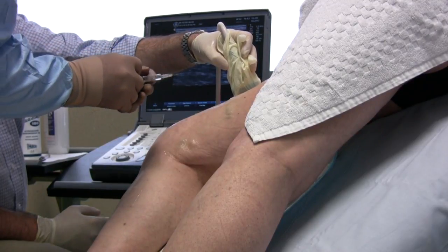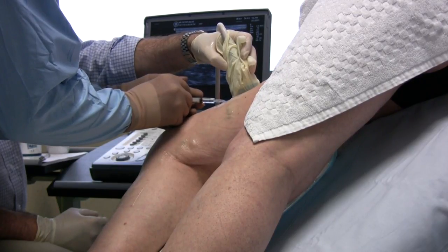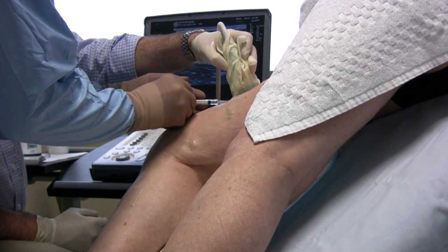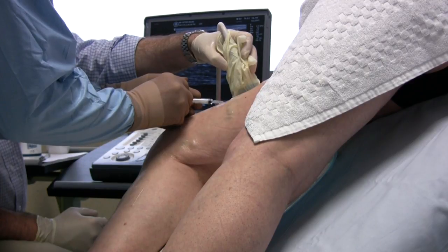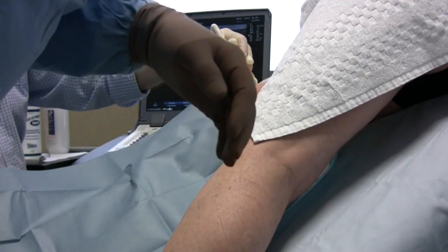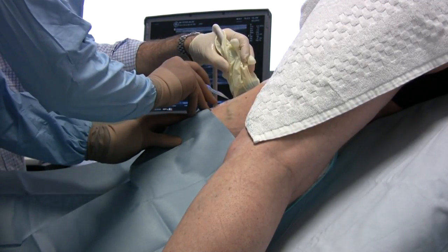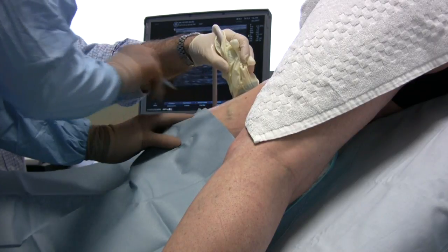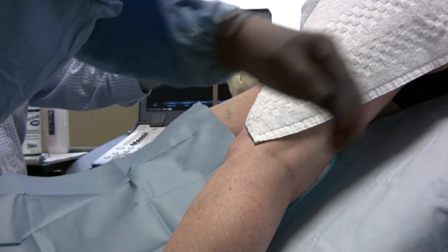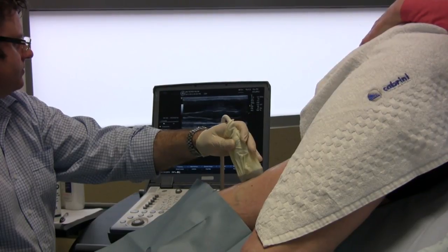Having decided the appropriate point of entry, a local anaesthetic is introduced over the vein to be accessed. The next part of the procedure is to make a small incision to admit the access gear. Following this, a needle is introduced into the vein.